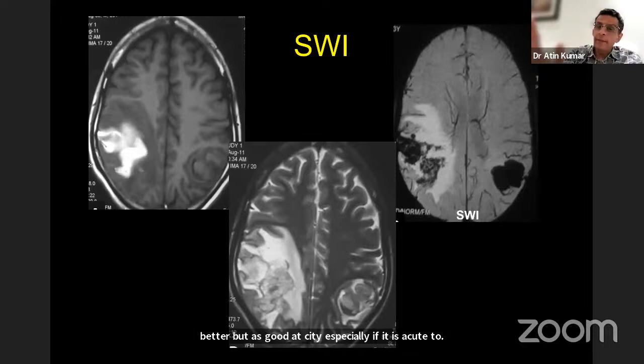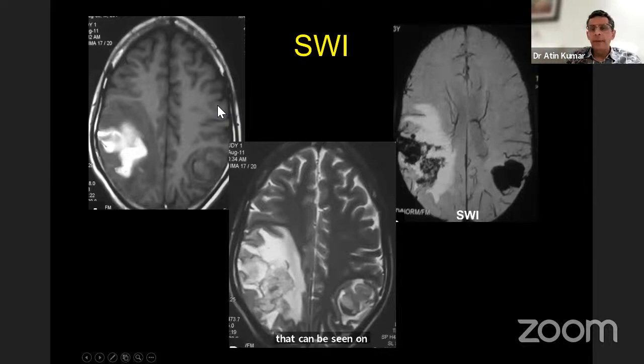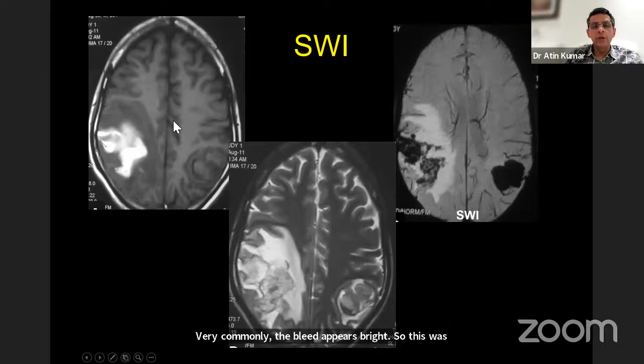However, if there is chronic bleed, a remote bleed, then we all know CT scan will not pick up bleed because bleed appears bright on CT scan in acute to subacute stage only. If it becomes chronic, then the CT scan will not show bleed as hyperdense. Whereas MR can still show bleed even if it is chronic, which may mean few weeks ago, few months ago, few years ago, all that can be seen on MR. Bleed appears complex on MR. On a T1 weighted sequence, very commonly, the bleed appears bright. So this was a T1 weighted sequence. How do I know this is T1?